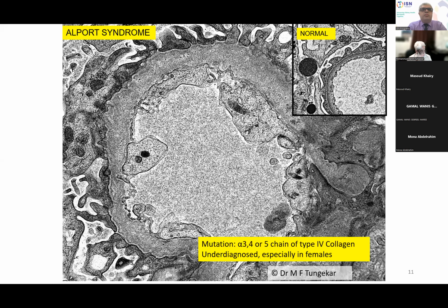glomerulopathy. C4 glomerulopathy is a new entity. If you Google it, you'll get it. But very few cases are described, all from his institution, Mayo Clinic, Rochester. Apart from that, C4D is present in lupus, membranous lupus, and membranous GN, as I said. Some have described it in post-COVID collapsing glomerulopathy, where the hyperplastic podocytes are positive for C4D. It doesn't add to diagnosis very much.